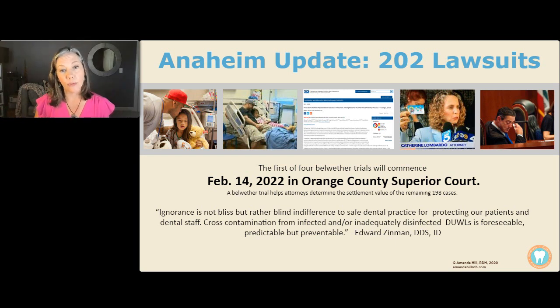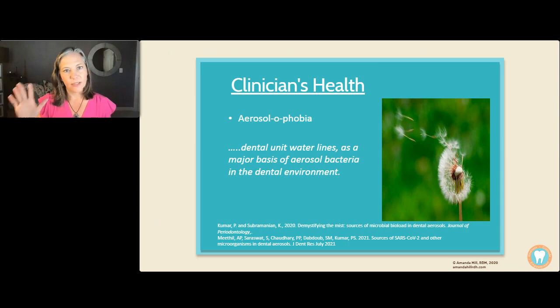The Atlanta case will go to trial just after Anaheim. They're waiting, I think, for the results so they have precedent. And I was able to talk to that lawyer in Atlanta, Drew Hill, no relation. And he is representing 11 of the families. Their waterline test came back at 91,000 colony forming units. And we said safe water is 500 colony forming units. So that's kind of a big deal. So we care about our patients' health, right? And so we've seen that the dental unit water lines can affect our patients, but it can affect our health too. And we forget about ourselves.